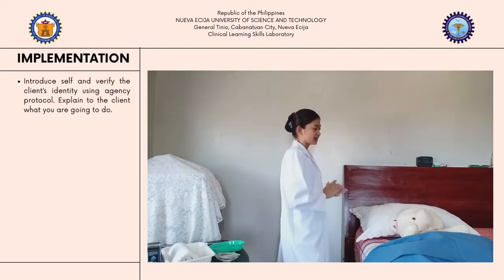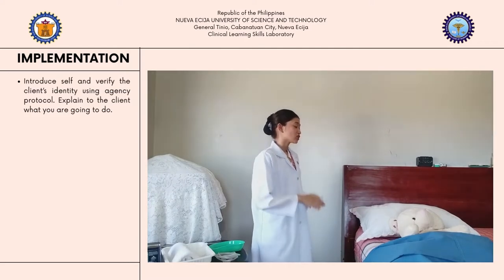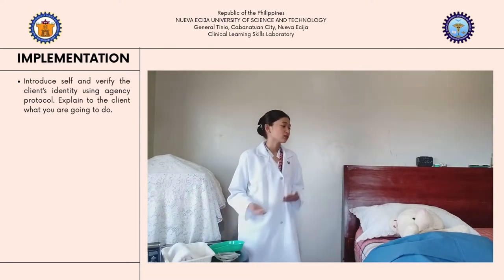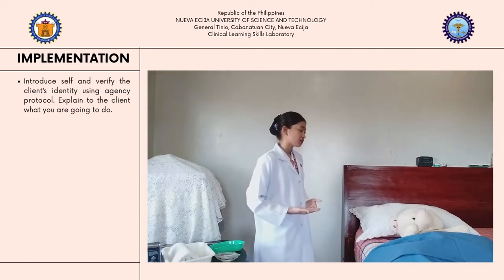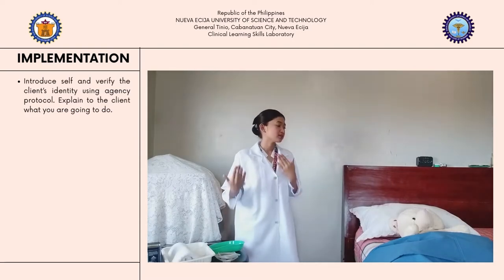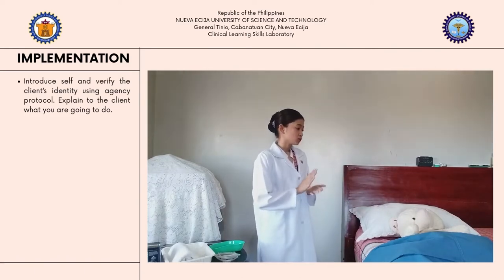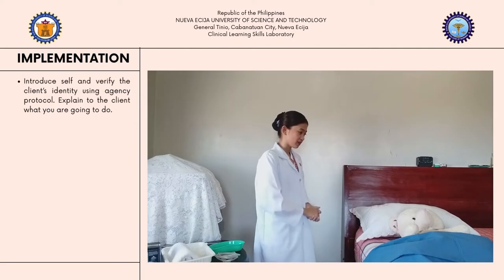Okay, thank you for that, but before we get started with our procedure, let me just walk you through the details of how we are going to do it. First, I will insert this tube into your nose and all the way to your stomach, and it will serve as the passageway for us to get food to your body because right now, you're having trouble swallowing and this is depleting your body of the nutrients it needs. And as I insert this tube, it may be a bit uncomfortable for you, but you should not feel any pain. But if you do, you can just raise a hand and I can stop for a while so you can rest for a moment.